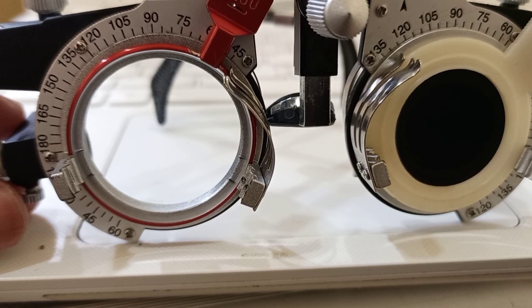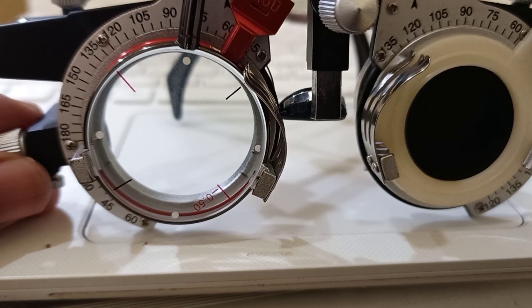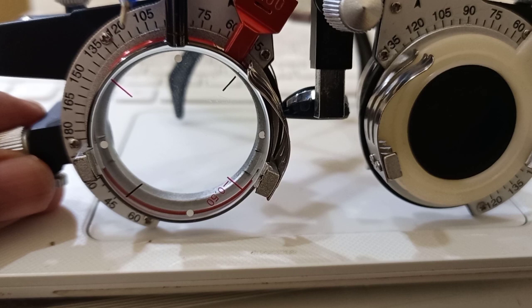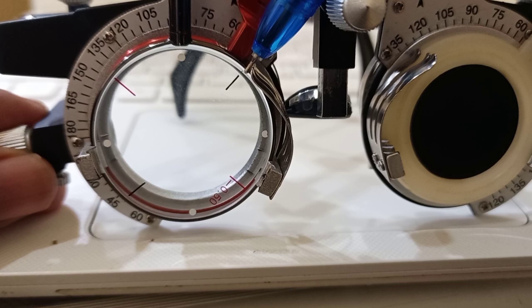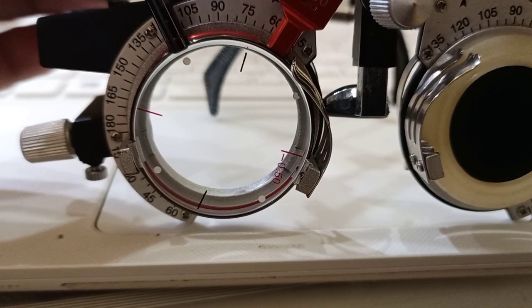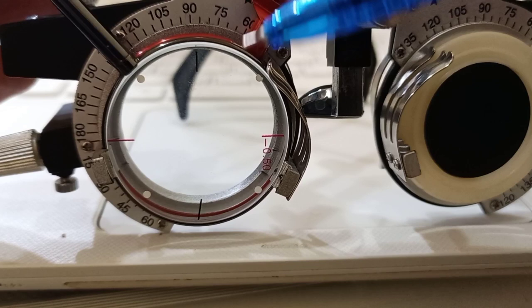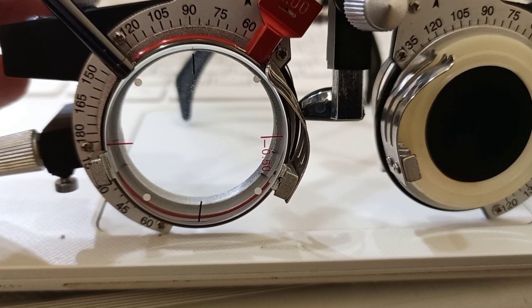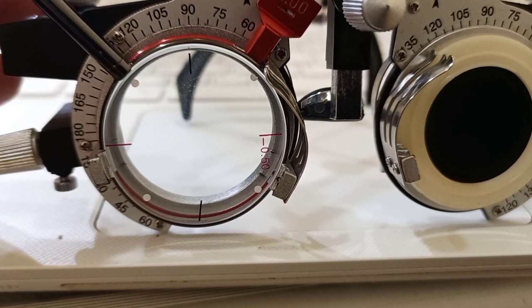To summarize bracketing: first we place the handle at 90 degrees, which confirms the oblique axes — the minus line at 135 and plus line at 45 degrees. Then we place the handle at 135 degrees, where the plus cylinder line coincides at 90 degrees and the minus line at 180 degrees. By placing the handle at 90 and 135 degrees, we have confirmed the vertical, horizontal, and oblique axes.